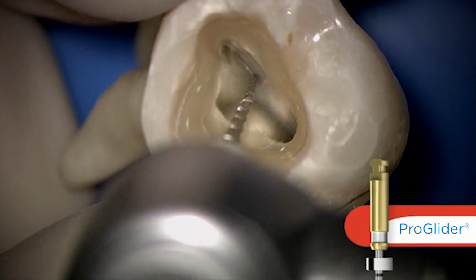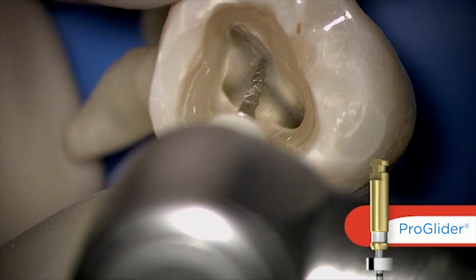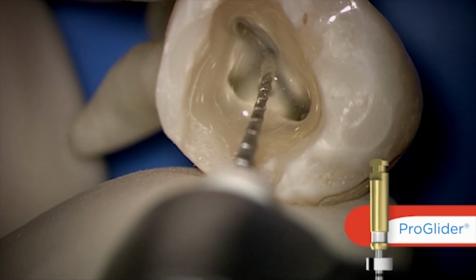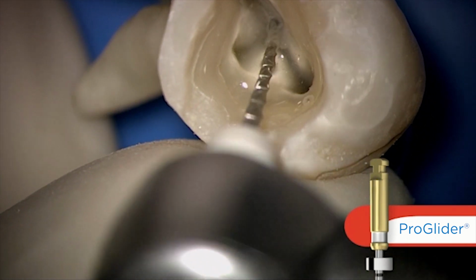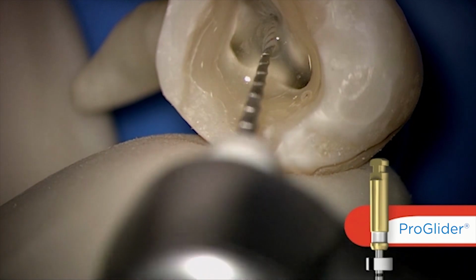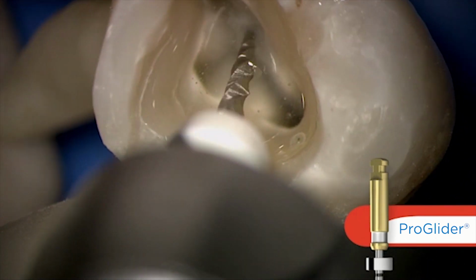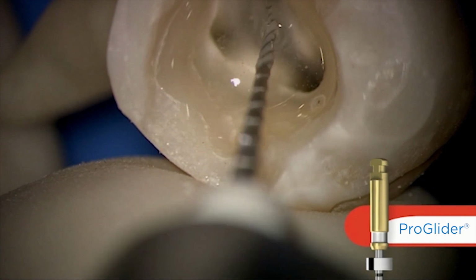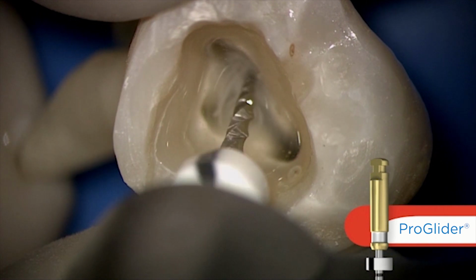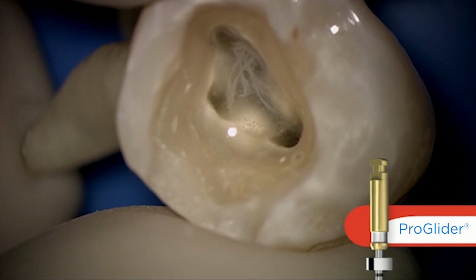Once the canal's been catheterized with a 10 file, we can come in with ProGlider. We can just let it run and advance towards length. If it bogs down, lift it up a little bit, a couple stops, and notice how the debris will auger up the flutes so the blades become active and still able to engage dentin and not too loaded with debris. Move the file in a little bit closer towards length, and when length is achieved, we can remove the file.